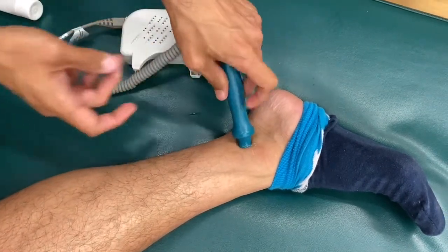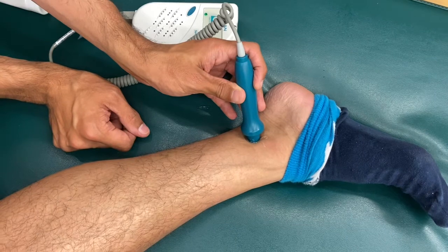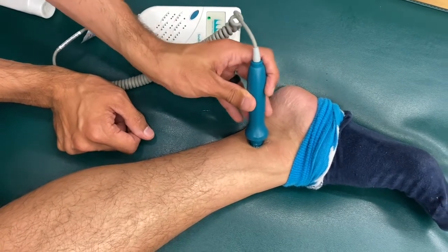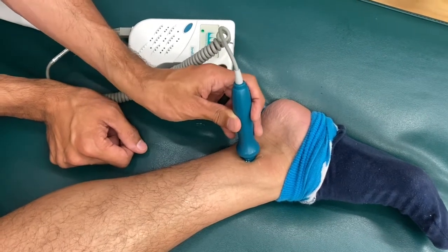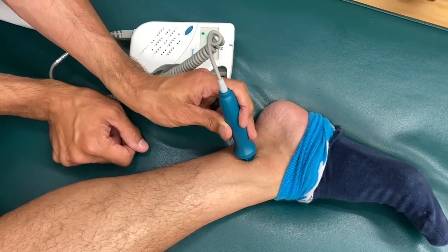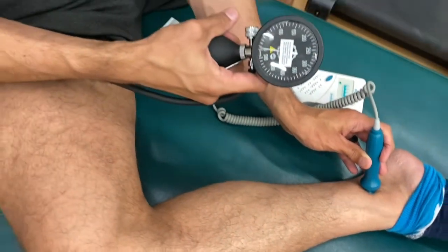So we know where it is, you might need to play around a little bit, but once you do start hearing the noise, the sound of the blood flow, the oscillatory sounds of the blood, we want to make sure that we rotate a little bit and make sure that we're getting the best possible, most robust noise possible. Okay, so that is very, very loud, very good. We want to press down nice and firmly so that we can keep that signal. Good. Then we're going to take our sphig here and start pumping up.